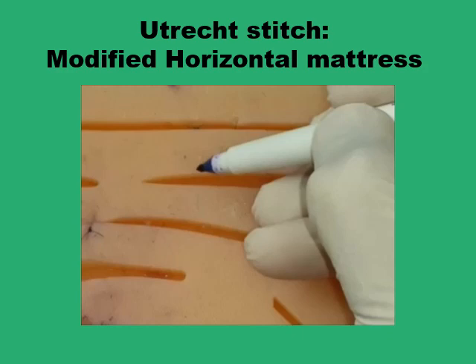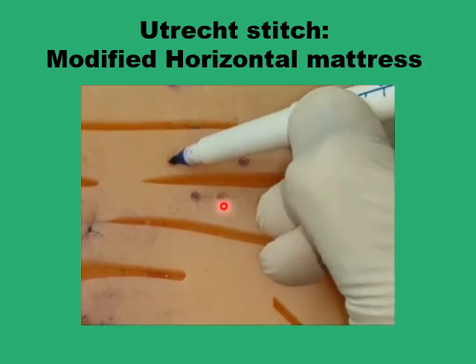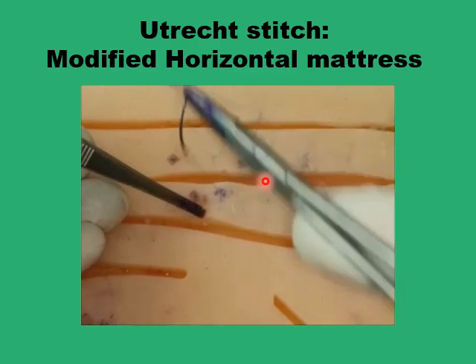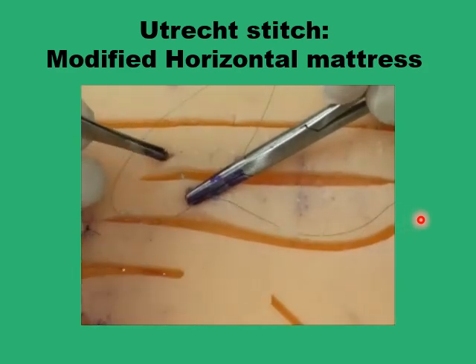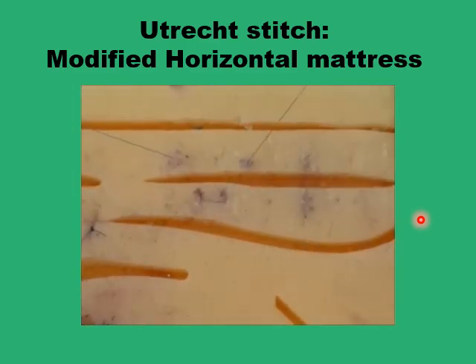Another simple modification to the horizontal mattress suture is the Utrecht stitch, where you change the shape of the horizontal mattress from a rectangle to a trapezoid. You have two points on one side of the wound that are closer to each other than the two opposite points. By having the suture line pass diagonally to the wound edge rather than perpendicularly, you spread the tension in a better way, providing improved dispersion of wound edge tension.